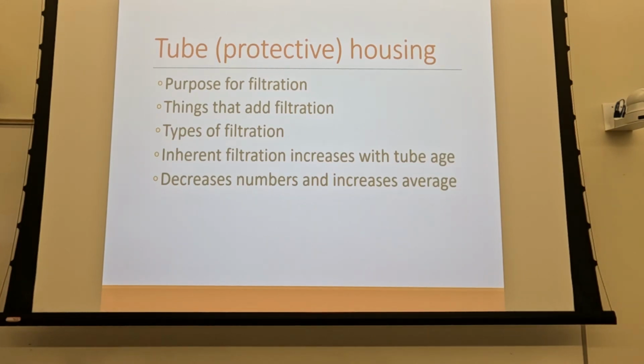So if the oil, the envelope, the port, and the mirror only get us to 1.5 millimeters of aluminum, we need 1 more millimeter of aluminum, right? That's still inherent filtration because we have to have it to get to a legal point of making an X-ray on a person. So 2.5 millimeters of aluminum. So that's inherent filtration. Everything else is added.